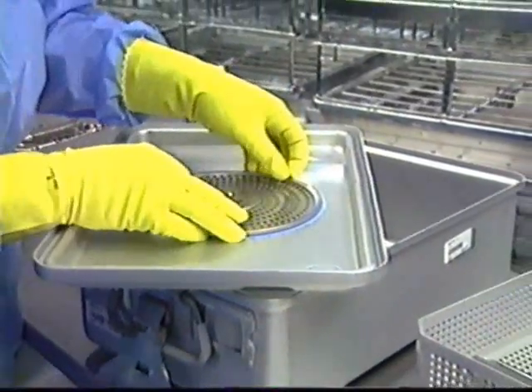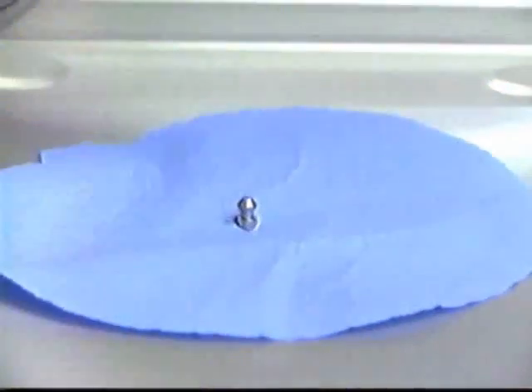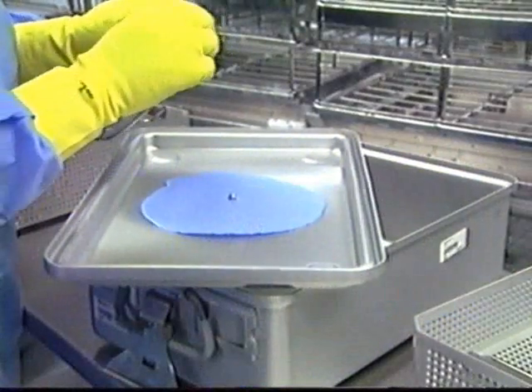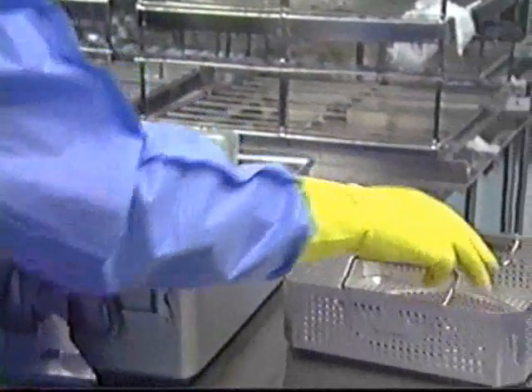Remove the filter retention plate or plates by turning the handle of the locking mechanism clockwise. Inspect the gaskets in each filter plate. Place the filter retention plate in a basket for cleaning.